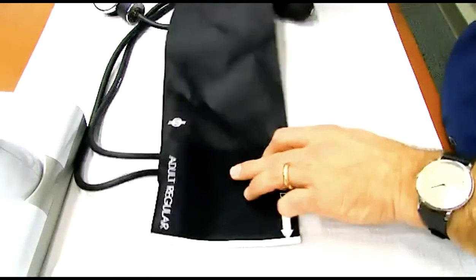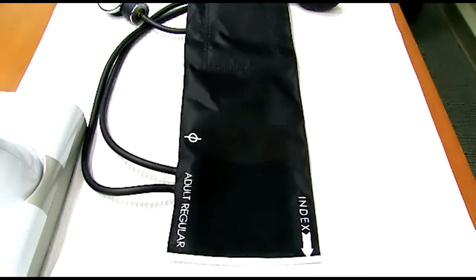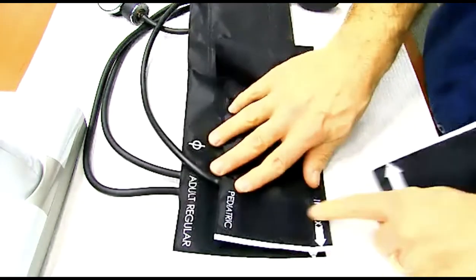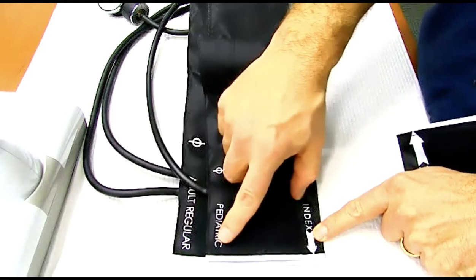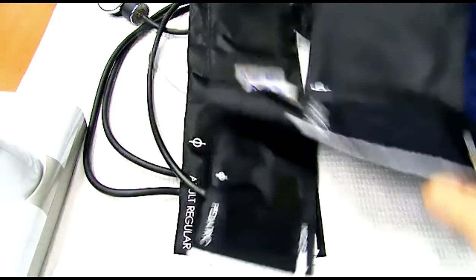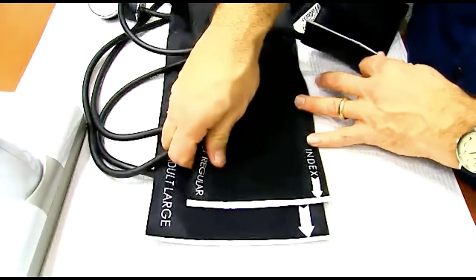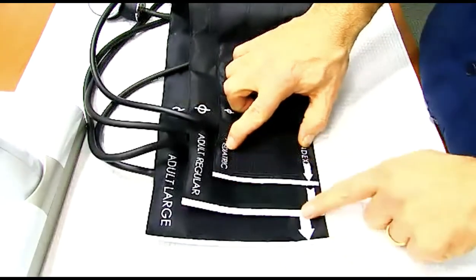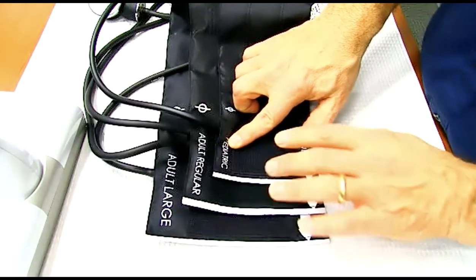The other markings, just so you realize, you'll notice your cuff says adult regular. I'll just mention this now so you can be aware that the cuffs do come in different sizes. So for example, here is an adult or a pediatric. And I'll show you the difference in circumference. If you line that up there, you'll notice that it's about an inch smaller in diameter than the adult regular. Compare that then to the adult large. So there's a large adult here, and then there's my adult regular there, and then here's the pediatric. So there are three different sizes with a difference in circumference in the arm. And it's kind of important. I'm going to show you how to measure, and we're going to use this white line here to make sure that you do have the right cuff size on there.